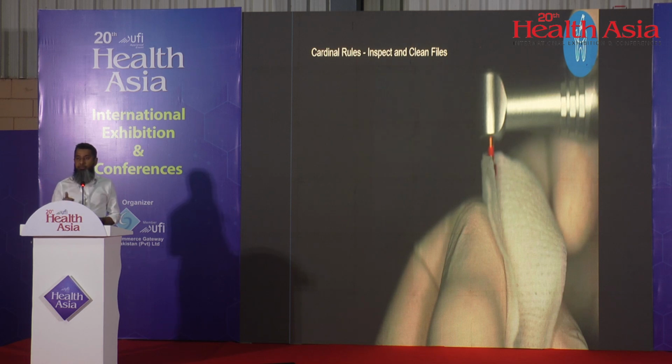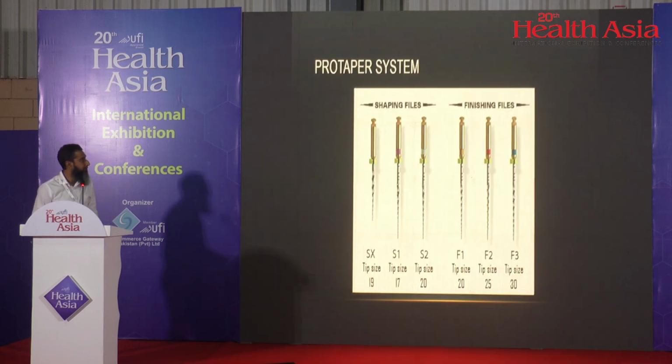With rotary files, the major problem is file separation. So for that, you need to be careful. The ideal guideline is that you just use your instruments only once. In every case, you can use new instruments, but here it may not be that feasible. So you can reuse your instruments, but you should always re-inspect the files. If there are signs of distortion, wear, any sharp areas, any bent areas, the file should be discarded. And if you're working in a molar, if you have worked in one canal, before going to the next canal, you can clean your files. The flute should be clean so that it can work easily in the next canal.